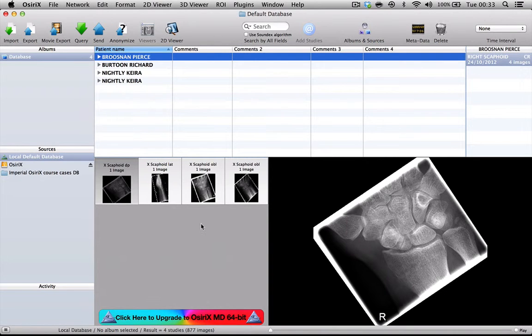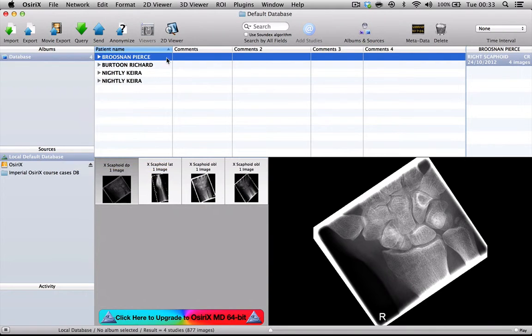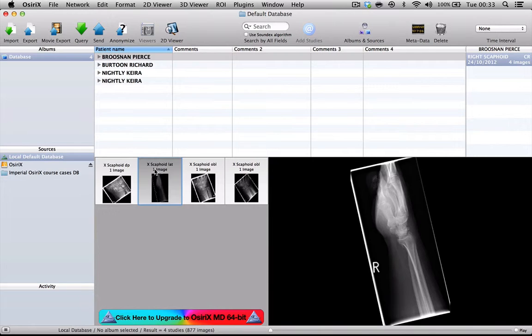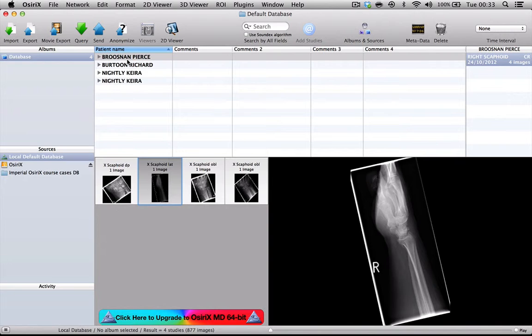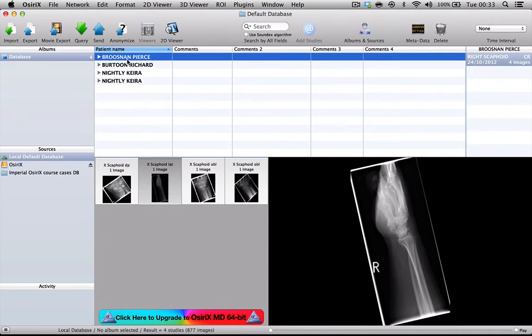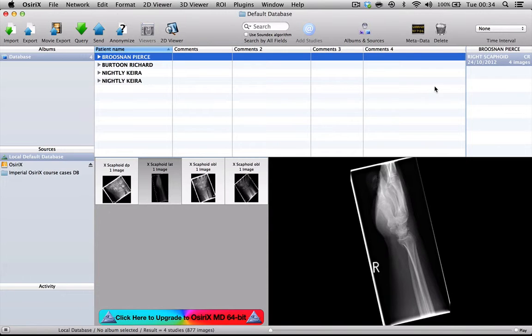Here I have imported into my local default database four patients. These are real patient images but the patients' names are fictitious. I've already been into the metadata and altered the patient identifiers for the purpose of this teaching exercise. If we look at the first case, which is a male patient with a wrist series, the first thing I want to show you is the metadata and the DICOM headers associated with this case.